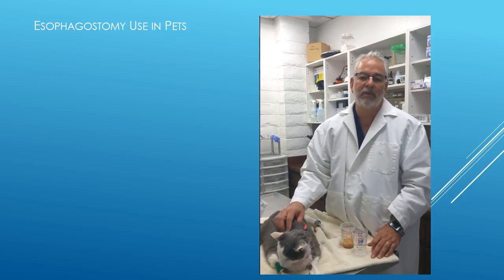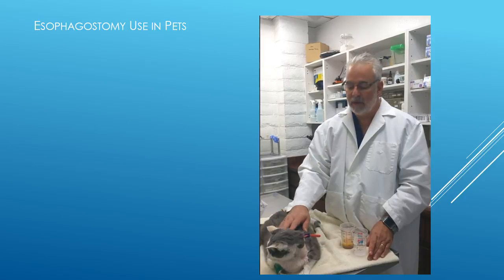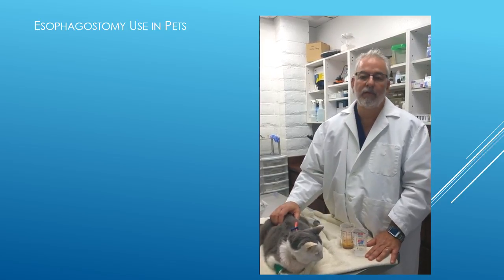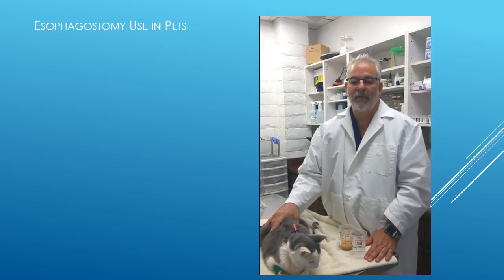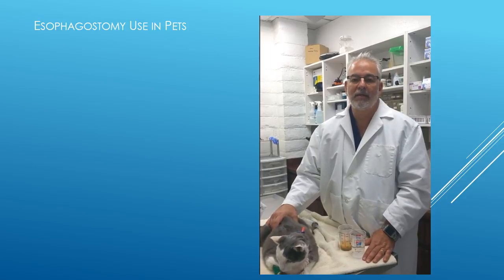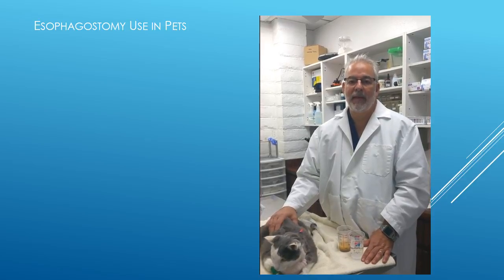These tubes can be maintained for sometimes up to six to eight weeks, providing the cat is tolerating it well, and that gives us ample time to get our food and drugs into the cat. If you have any questions about this or any part of your cat's health care, please call us at 909-980-3575. Thank you for listening.